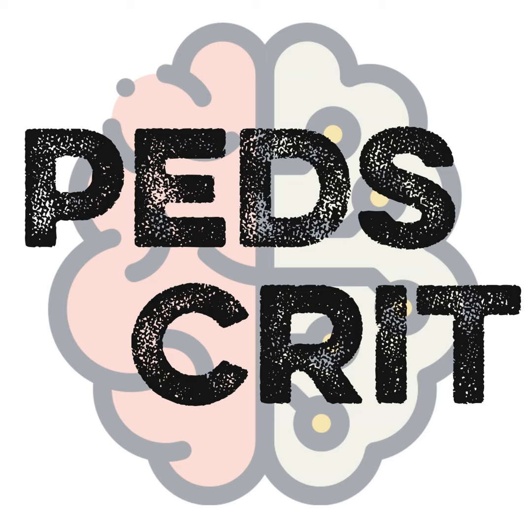VA-ECMO, as the nomenclature states, so the first letter is always where you're draining from, and then the second letter is where your inflow goes, so to speak. So VA-ECMO is veno-arterial ECMO. Essentially, you're draining the venous blood, making it go through a pump and an oxygenator, and then it comes back into your arterial system. So that's how I would describe veno-arterial ECMO, as opposed to VV, where you drain from the venous system and then it is put back into the venous system.